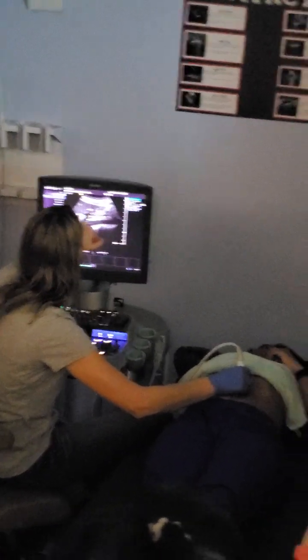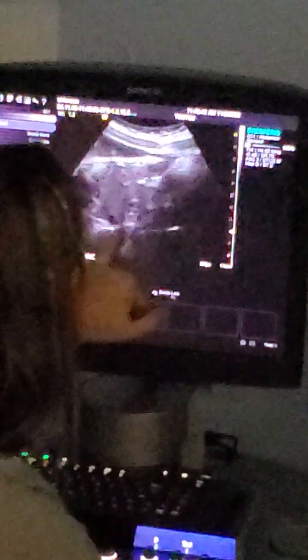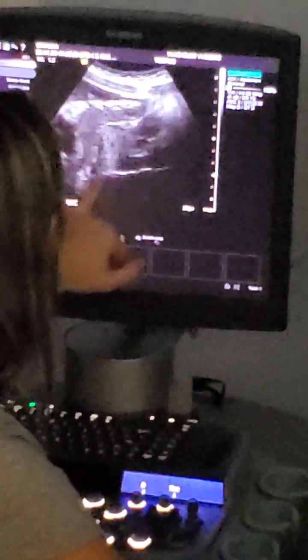So here, let's look at our aorta. We have the aorta here, and a little bit of pancreas here. If we go this way, we're at the pigtail, and there's a splenic vein going all the way over that spleen, kind of gassed out.